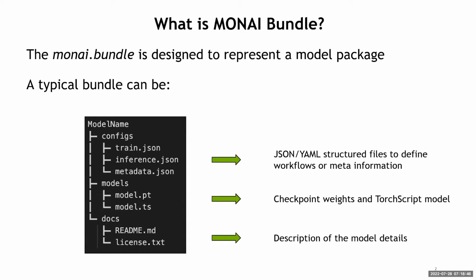A lot of information you can put into the metadata.json file that comes in your bundle, which is just going to be a directory containing some subdirectories as shown here, with some config files and the actual model weights itself, as well as some README files and other documents. So the idea here is that we're going to include the saved weights for a model, as well as optionally the TorchScript model. You can also include the ONNX version of your model as well too. And so all that is going to be there that's compatible with PyTorch already. And it'll be the PyTorch objects that you're already familiar with, but we're layering on top of that in an additive way these configuration files that describe things in a more semantically rich manner.